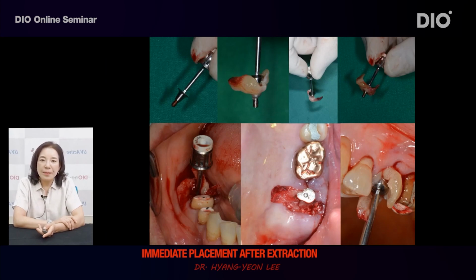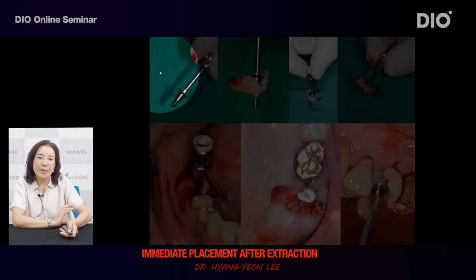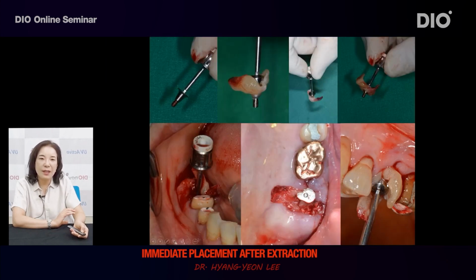If the hole is small, healing abutment can be put in without PRF, and PRF can be mounted on the healing abutment. In other cases, only bone-forming screw can be mounted, or by mounting the PRF onto the bone-forming screw. In this case, PRF was mounted on the healing abutment, but it appears that it would have been fine even if PRF was not mounted.